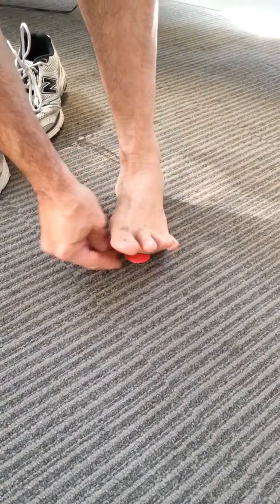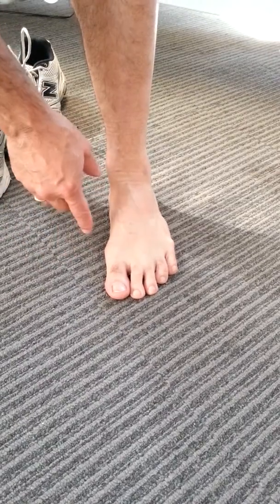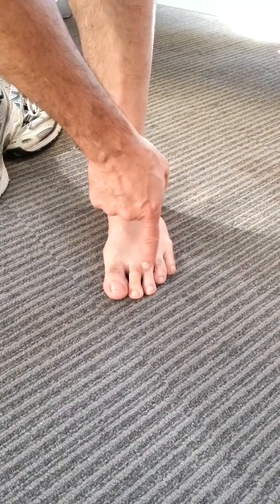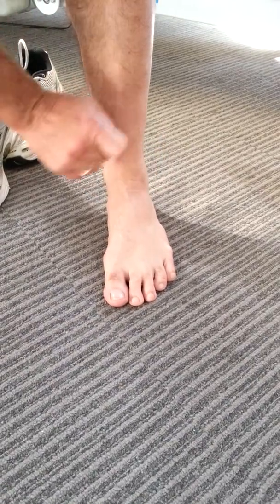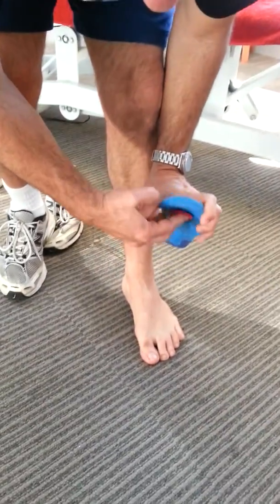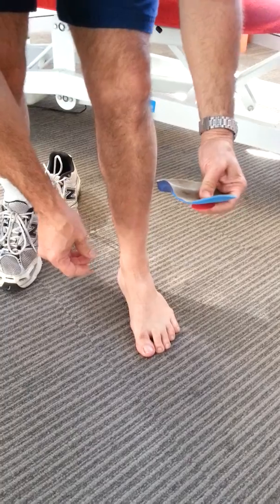If I just pop that underneath there, you may or may not see a marginal difference. What happens is the toes come apart a little bit and it spreads those two bones I was talking about before out. So what we're going to do is put this in the orthotic underneath there so that it provides support for that part of the foot.